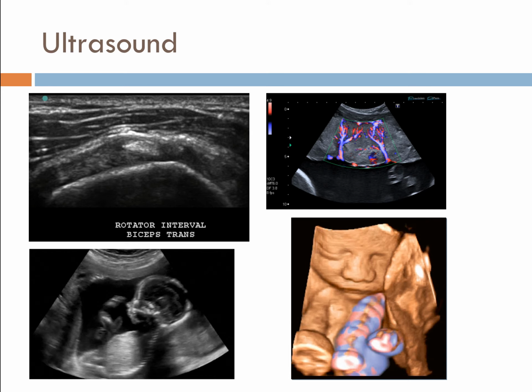And so ultrasound, again, is a point of care option, which means... An MR unit needs to have a room that's shielded away from extraneous metals and RF interference. So they have outside of them what's called a Faraday cage, so RF can't get into the room and disrupt that flipping of the hydrogen protons. It's certainly a purpose-built room.